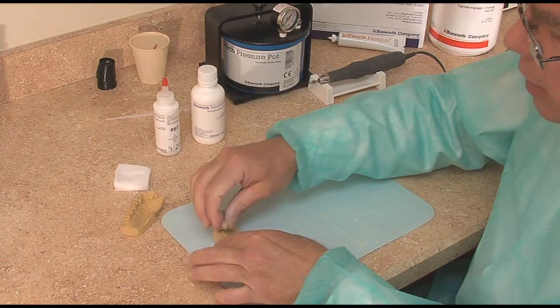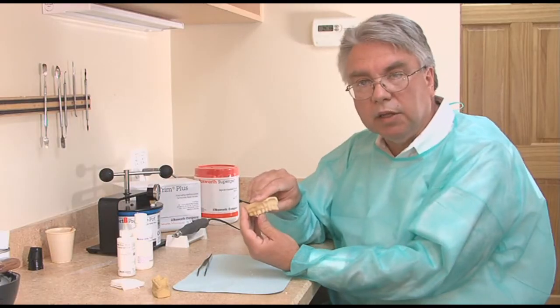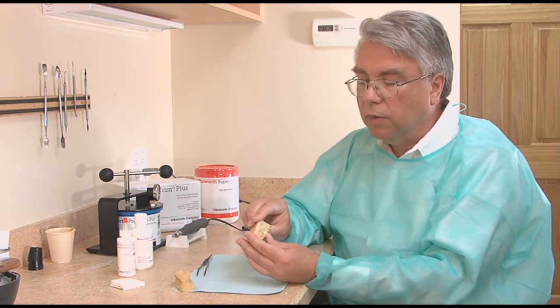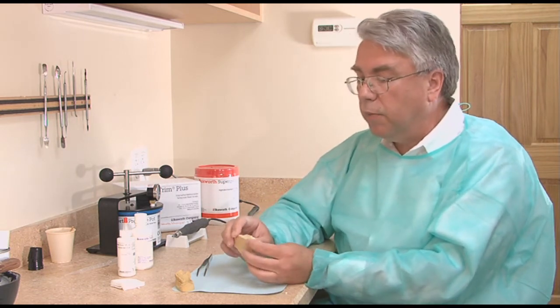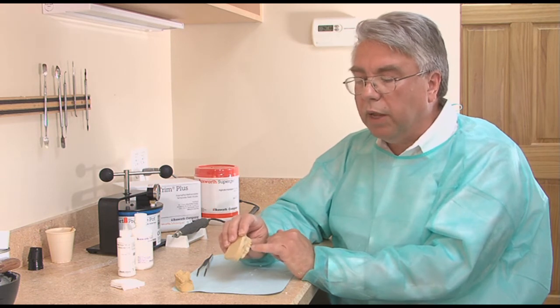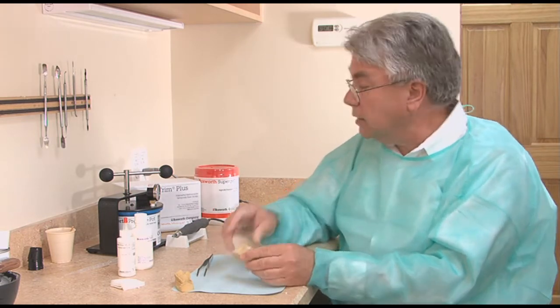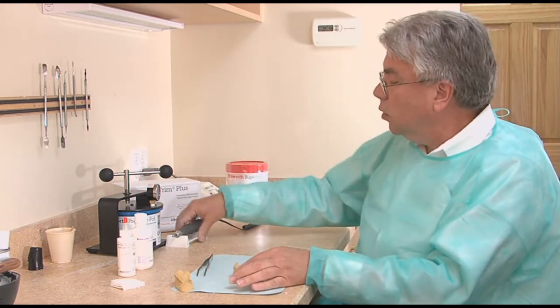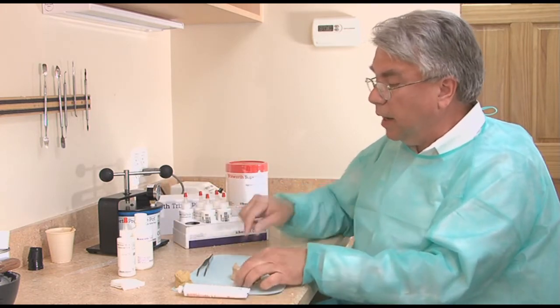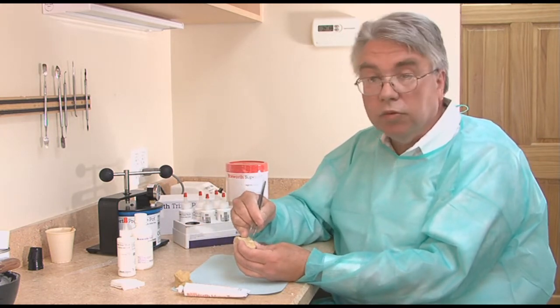Using Trim Plus, generally everything blends in pretty well anatomically because you duplicated the tooth before it was prepared. However, sometimes the colors may be a little different. I've had patients with either some tetracycline staining or their other teeth may have some hypoplasia due to orthodontic work, and they don't want me to cover that up with composite.